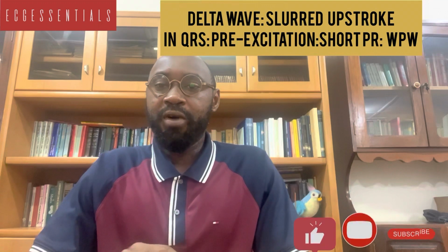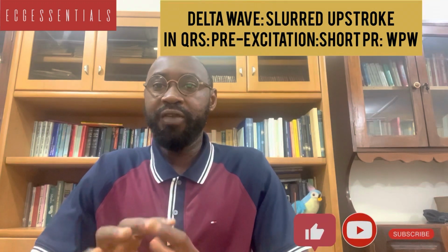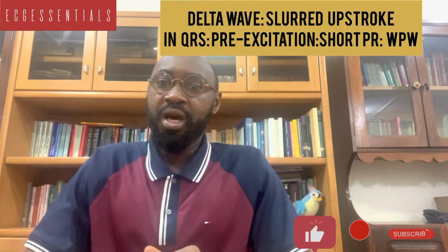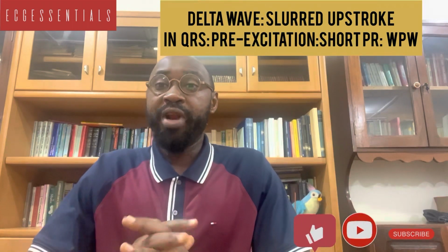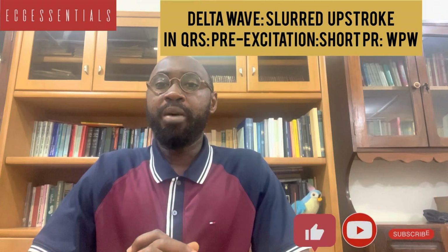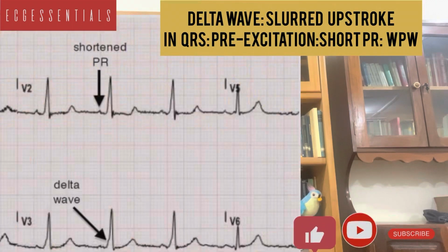The next uncommon wave that we have to mention and probably look out for when we are reading an ECG is the delta wave. And in the earlier part of our discussion, we mentioned the delta wave as being significant for Wolff-Parkinson-White, which is one of the commonest pre-excitation syndromes. And this delta wave is a slurred upstroke. It's described as a slurred upstroke in the QRS.